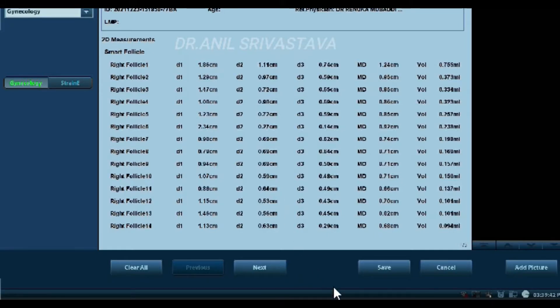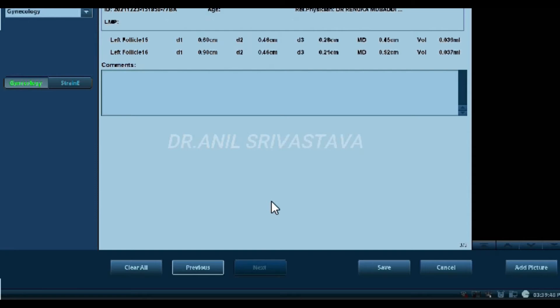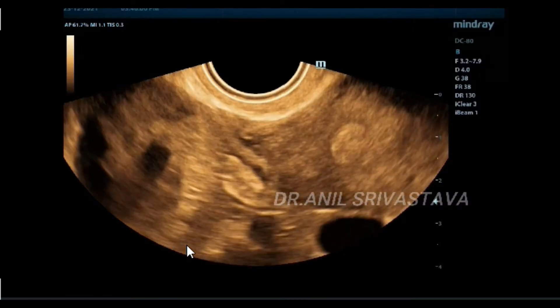These are the follicular counts — this is from the right ovary, and this is from the left ovary.